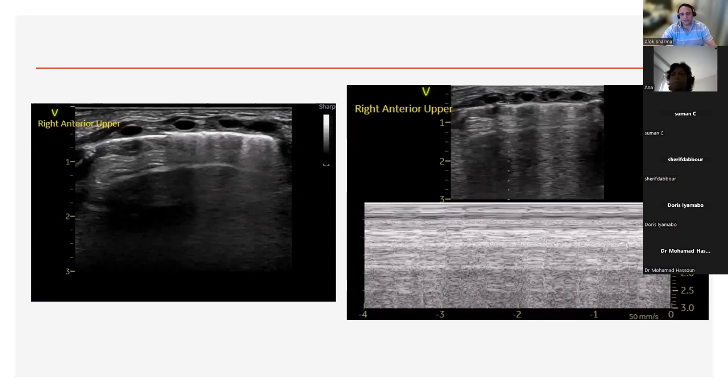So let's go into the chat box. Anna, what would you like to do? Okay, you want to do a needle? To needle. Okay, so let's see. Anybody want to do a chest X-ray? If it takes too long. Yeah. Do you want to say something? Maybe without the lung ultrasound, we would do that if the X-ray didn't come sooner. Yeah. So with that lung ultrasound, I would not have doubts.